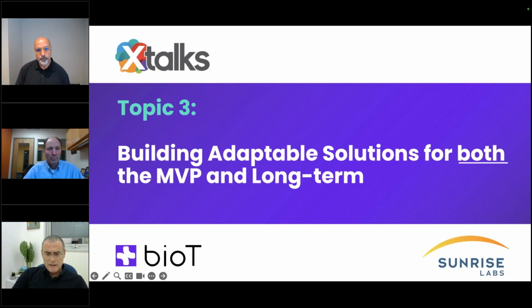The other item that you need to look at is cybersecurity and privacy. But in this case, you need to treat the cloud as your friend rather than your enemy. I see also many MedTech companies saying we will get to the cloud only later. We want to pass FDA approvals or compliance without the cloud because it introduces risks. And after we do that, we move to the cloud.